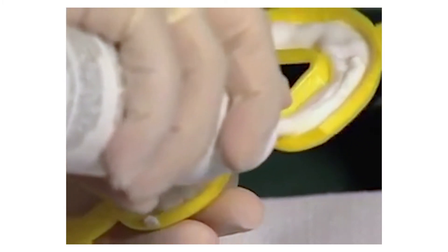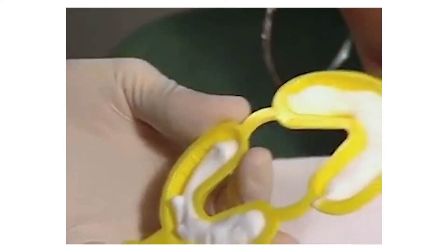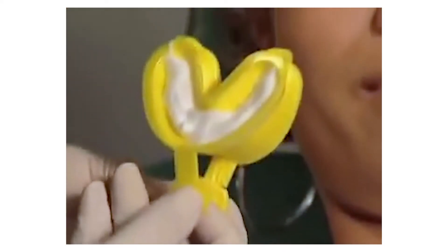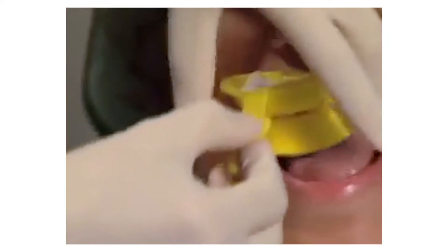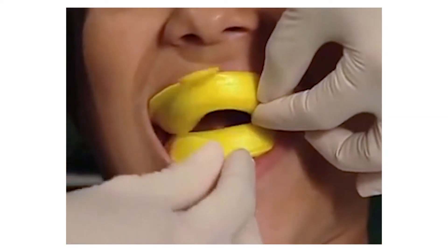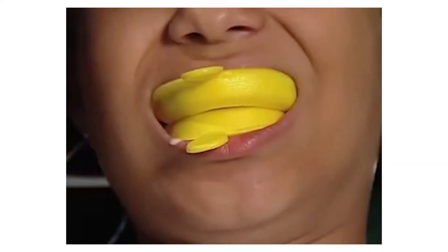Because she's got a little tiny mouth and we want to make sure we don't overload that. I'm going to close it just like this. Haley, I'm going to have you open for me — we're just going to squeeze it in there and bite into that for me.